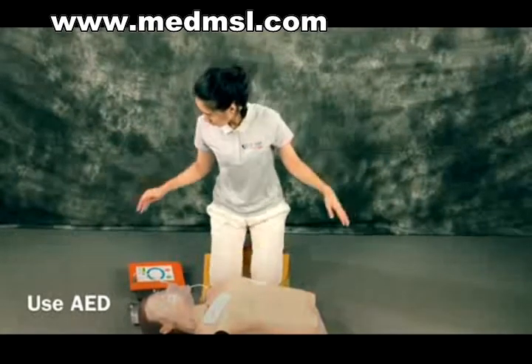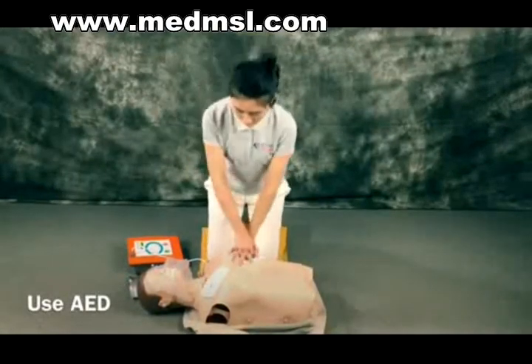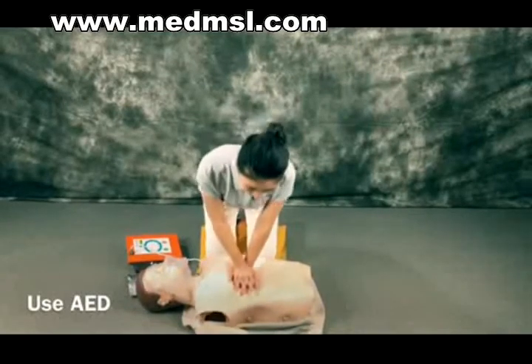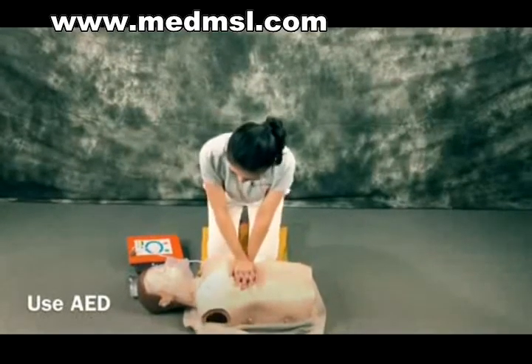If a shock is indicated, ensure that nobody is touching the victim. Press the shock button as directed. Immediately restart CPR using a ratio of 30 compressions to 2 rescue breaths.